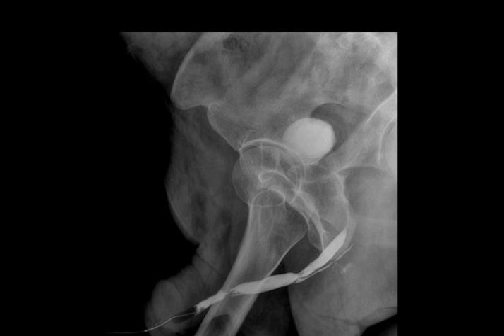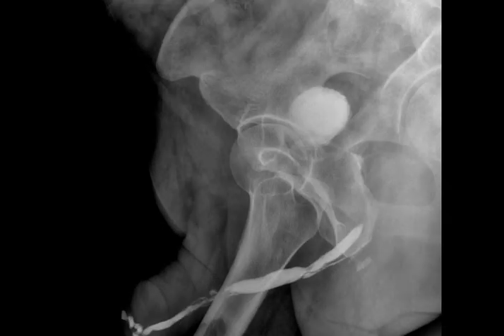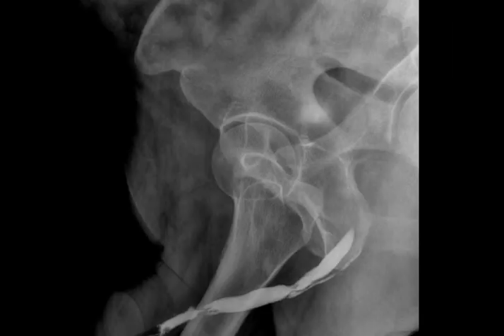Okay, how many images do you take? I think 4. How many will you take for this one? Until I feel satisfied. Sometimes I take 1 and it's enough. Sometimes I take 6 or 7. Mostly, the most important thing is the oblique. Very important to have an oblique because you'll see the whole urethra in extension.